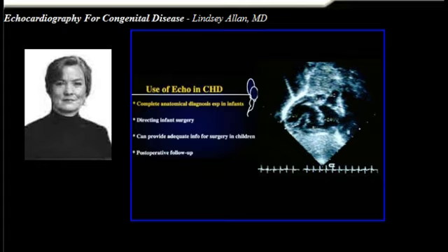Now let's turn to the use of echocardiography in congenital heart disease in postnatal life. And the first starting point is that you can get complete anatomical diagnosis, and this is particularly relevant in the infant. And you can see in this fetus, I'm always talking about fetus, but this is a child, of course, and what we're seeing is almost the whole anatomy on this single section.